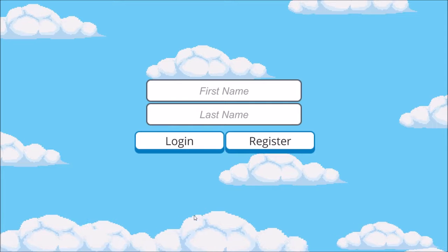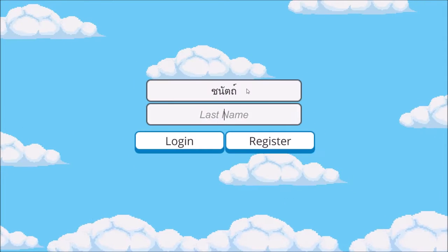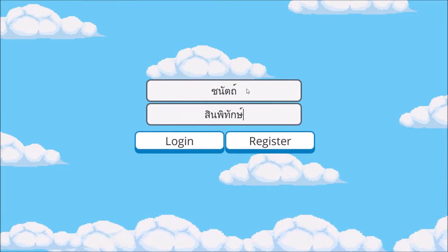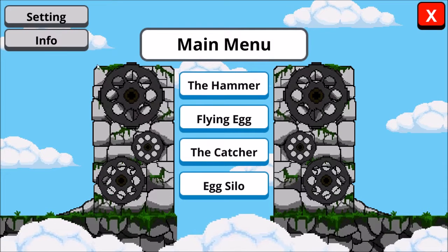Type the first name and the last name for logging in. Click on the login button or press enter to login.